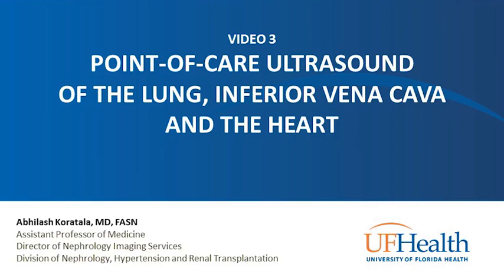Determination of volume status in critically ill patients with multiple organ dysfunction and those requiring dialysis is a frequent challenge faced by nephrologists in routine clinical practice. A quick bedside sonographic examination of the lung, inferior vena cava, and the heart provides valuable information when coupled with physical exam findings, vital signs, and other laboratory data.